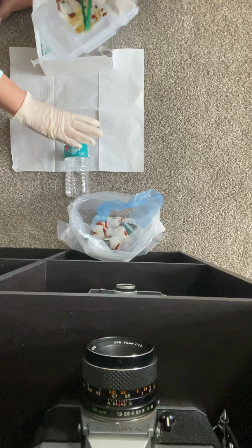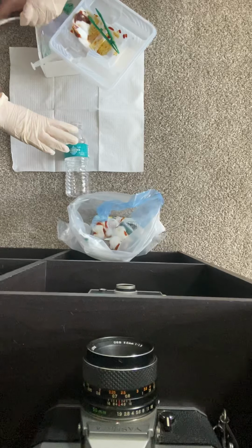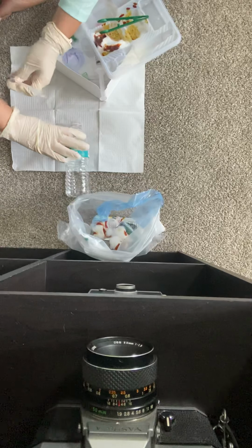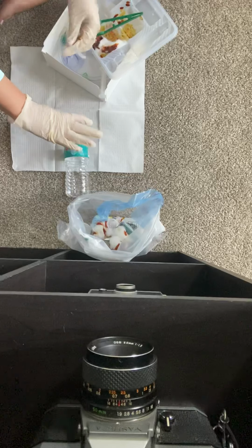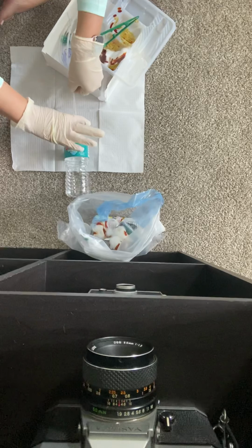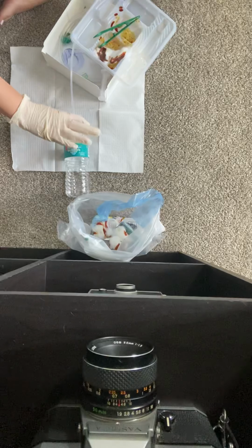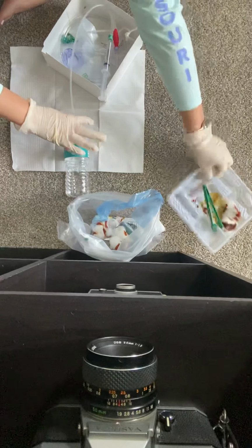So what I'm going to do next, I still have the labia exposed here, and I'm going to insert. I'm going to move this out of the way because I don't need it anymore.